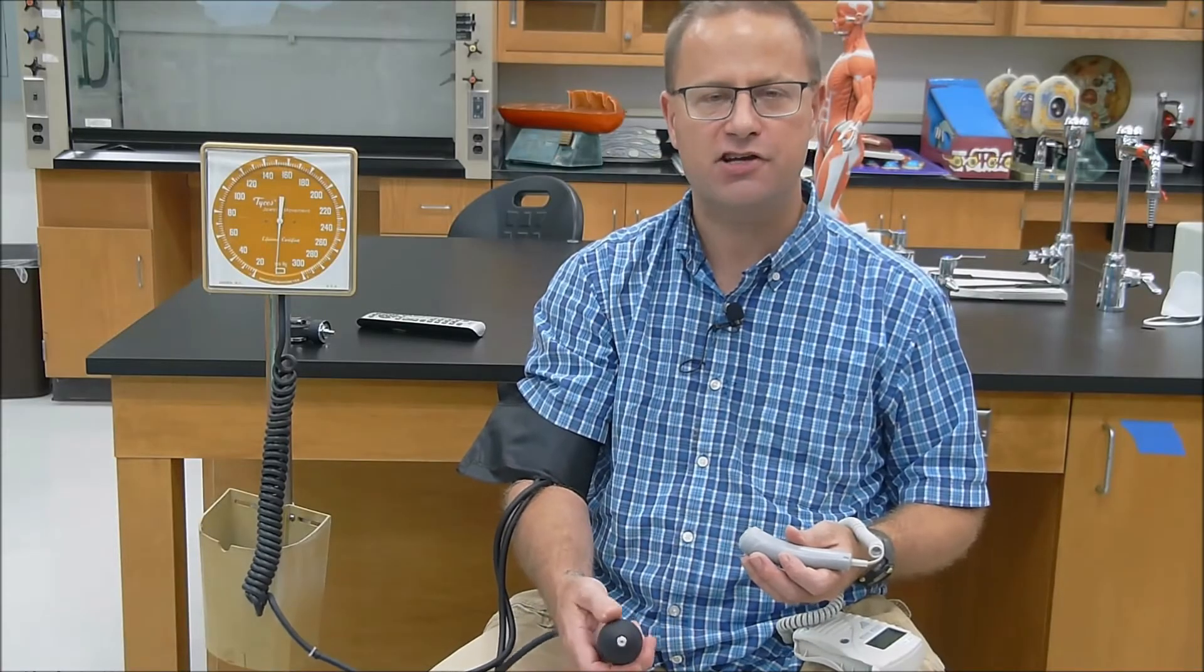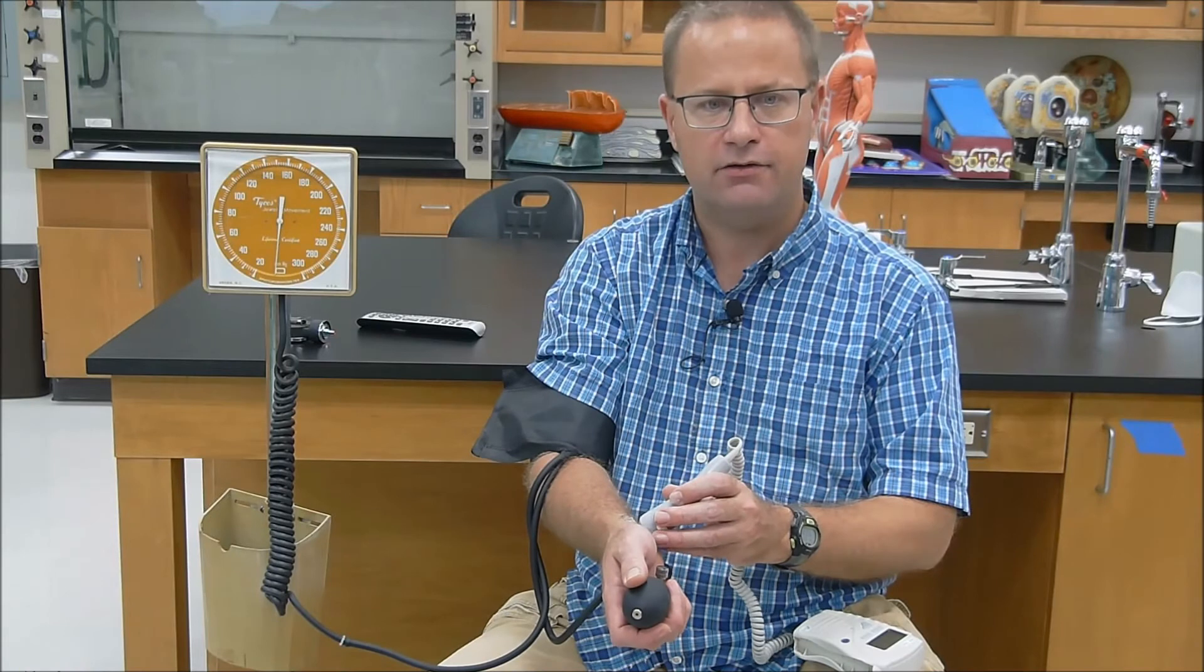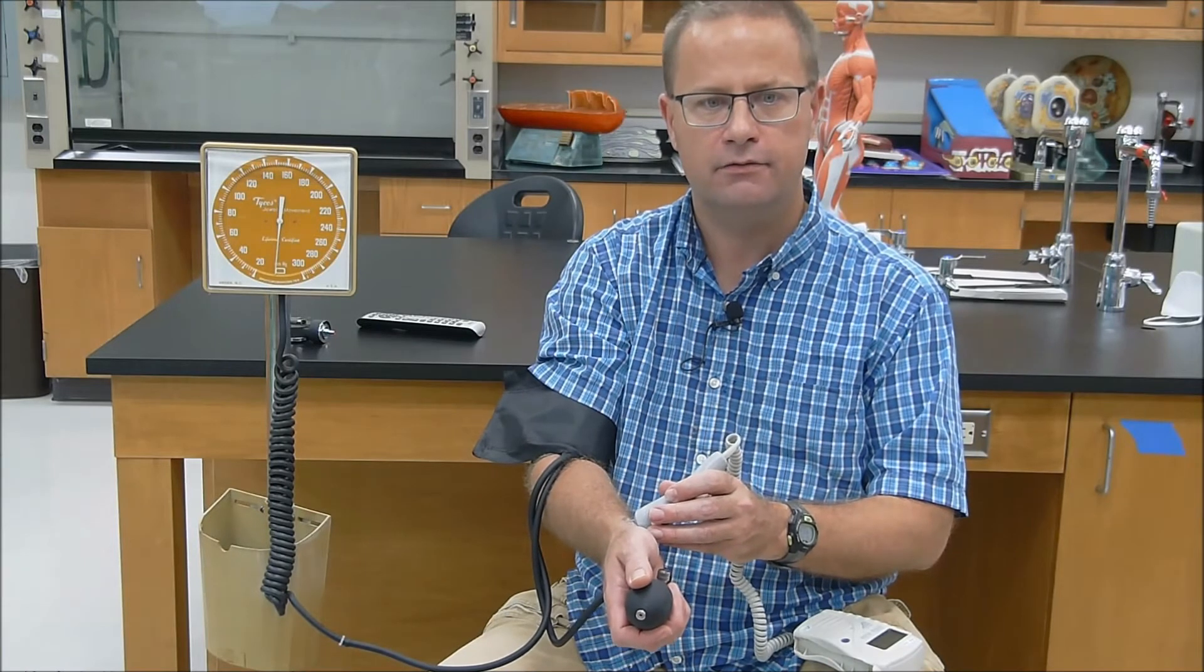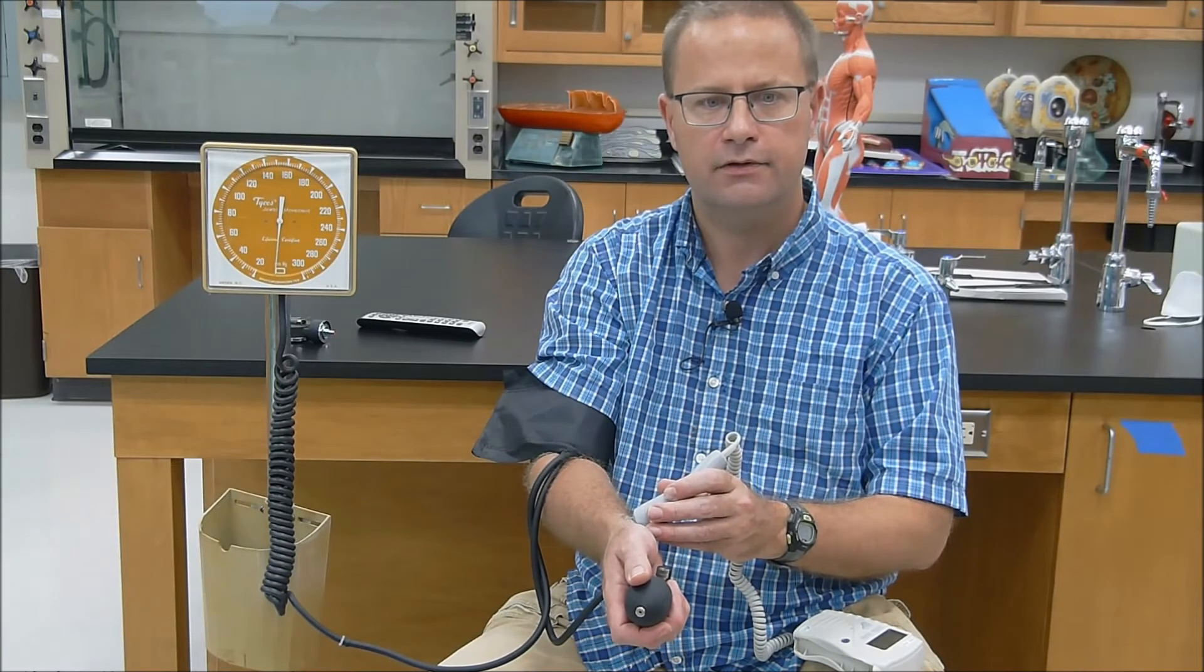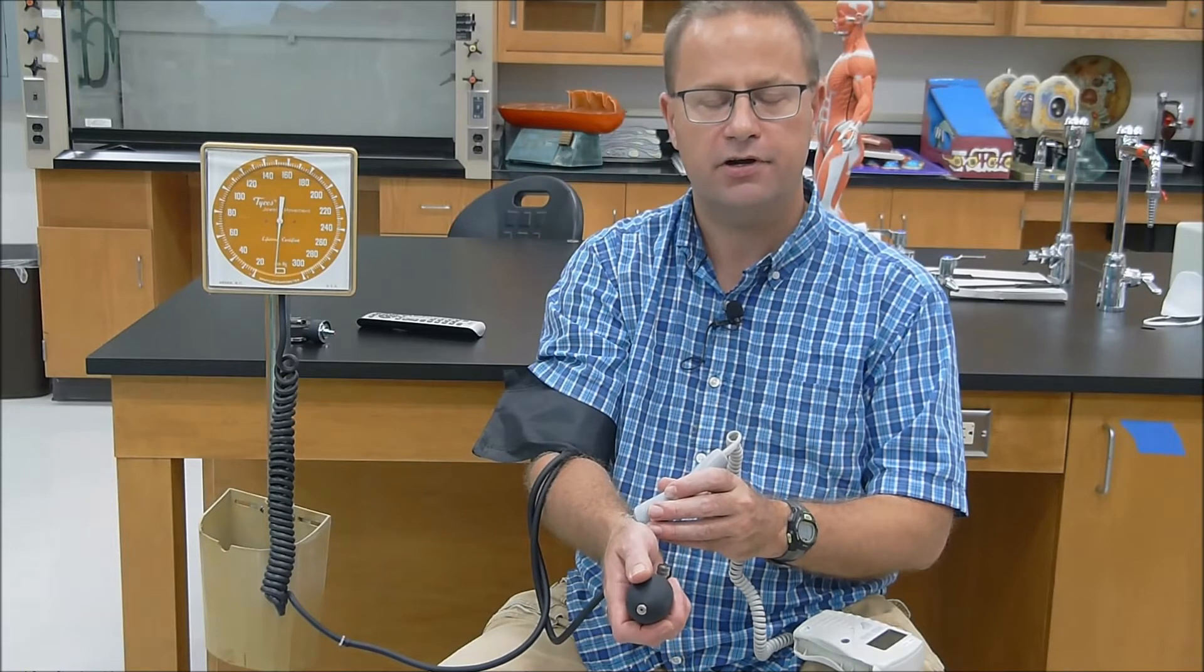In the previous demonstration, you couldn't really hear what was going on in my stethoscope. So what I brought in here today is a Doppler blood monitor, and that's going to let you hear the blood rushing past in my radial artery. So I'm going to put this on right now before my cuff is inflated. You can hear a pretty good pulse going right now.